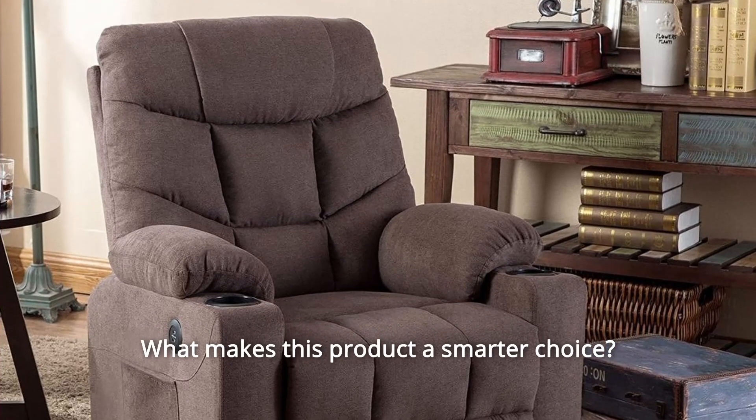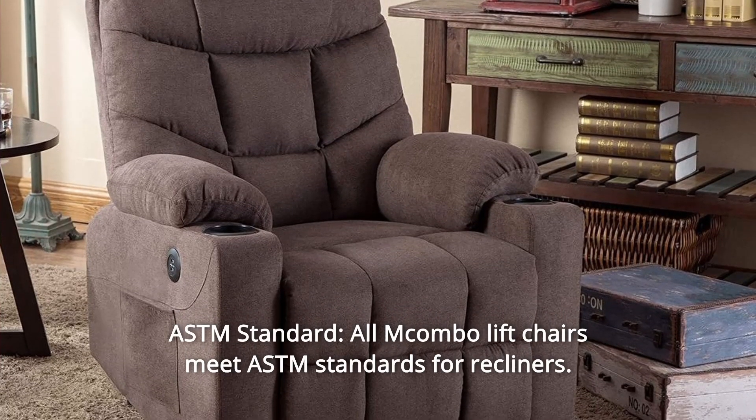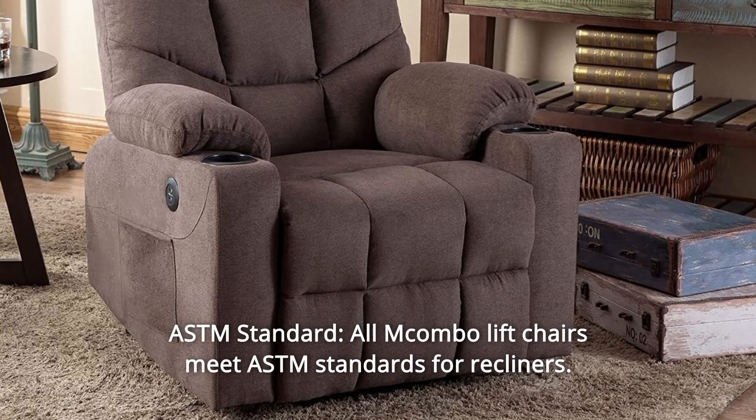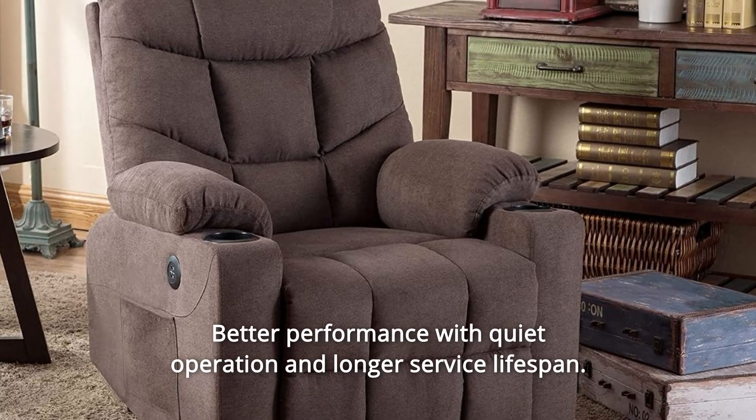What makes this product a smarter choice? Number 1: ASTM Standard. All Mcombo Lift Chairs meet ASTM standards for recliners, with better performance, quiet operation, and a longer service lifespan.